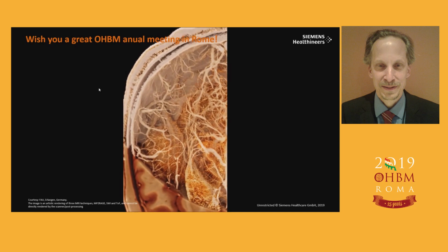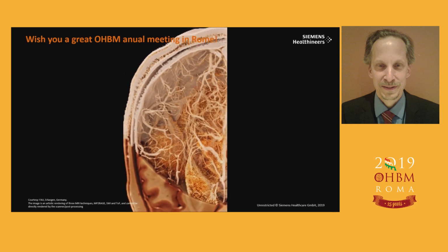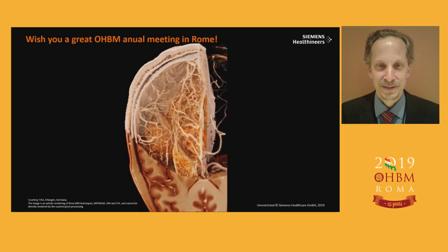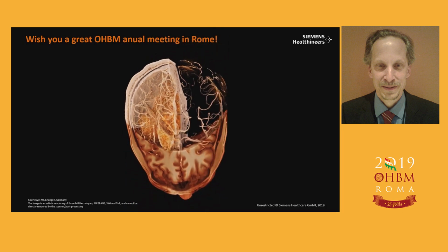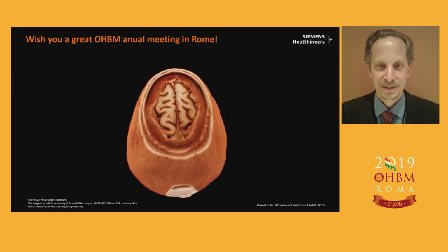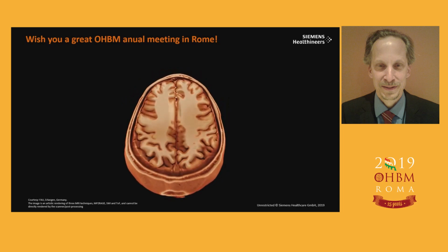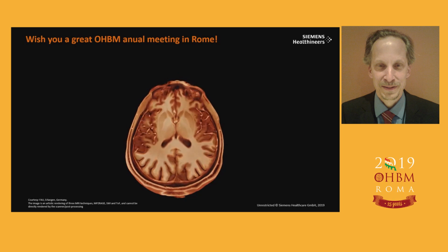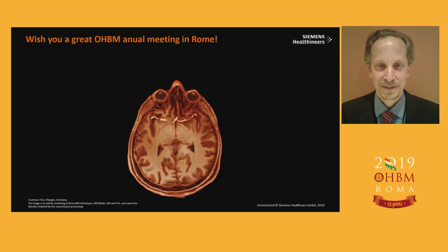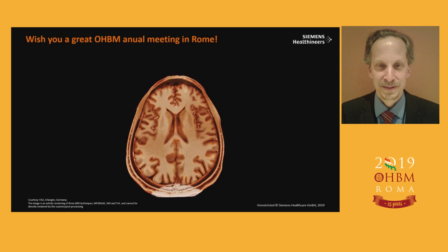The interesting thing is if you look here between the cortical bones, there's a structure, the diploe, which is a kind of trabecular bone structure in the bones, which became visible because we inverted the SWI contrast. I really love it. It looks like a CT image here in this case, but it's an MR. And I don't love it only because it's so beautiful and amazing. I also love it because it's my own brain, and I'm super proud that this was shown 2 years ago at ISMRM, and I have to tell everybody about it.